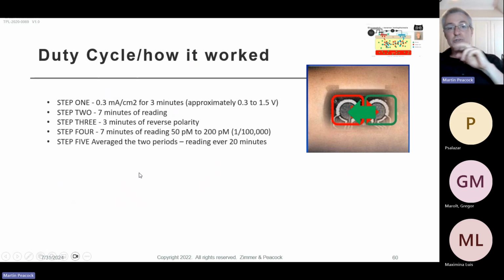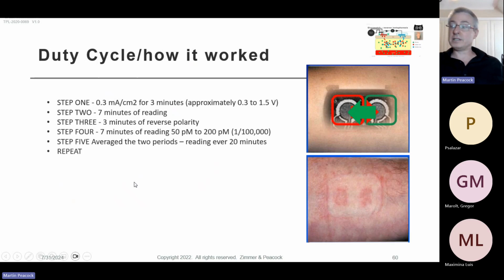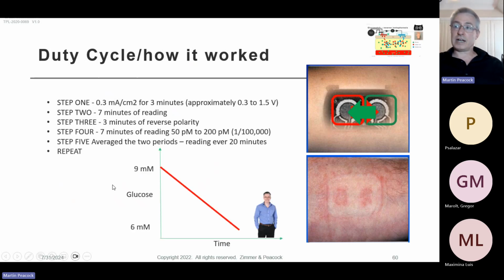Now, what they would do is two readings over the course of 20 minutes. On one of the systems they'd make a reading, and then on the other system they'd make a reading. And they would repeat that and average it. As I say, it could lead to a bit of soreness on the arm. Now, the fact that they were doing two readings and averaging means that if your glucose was falling, you could take a reading on one of the electrodes and it was 8 millimolar. But by the time you came to the other reading, this person's glucose is genuinely falling, and when you extracted it, you ended up extracting something that was probably more like 6.5 millimolar.